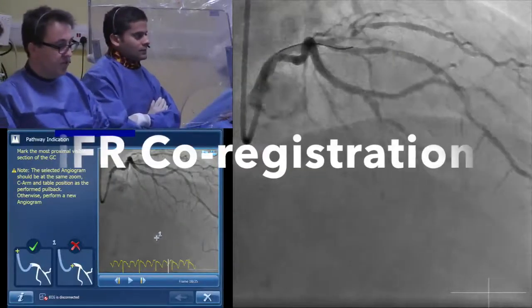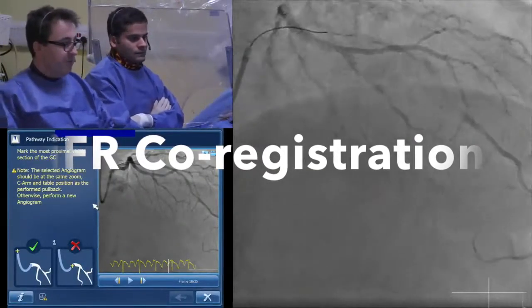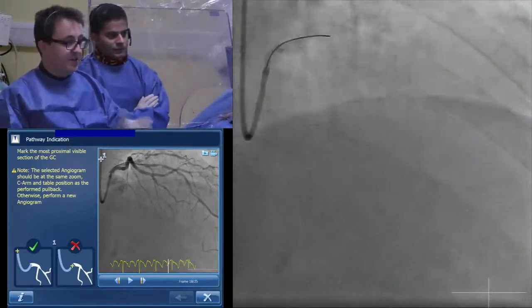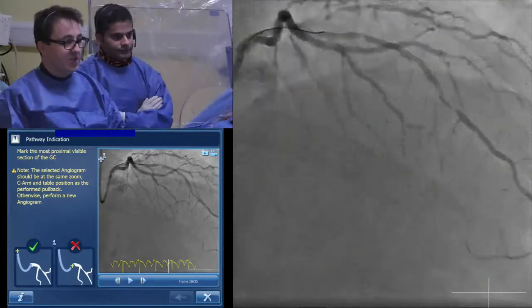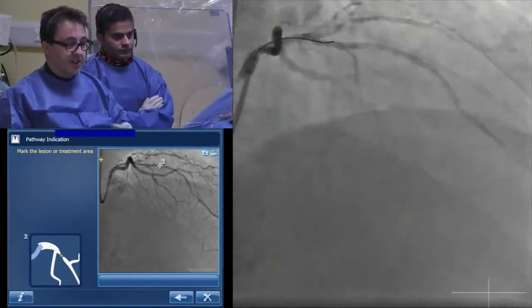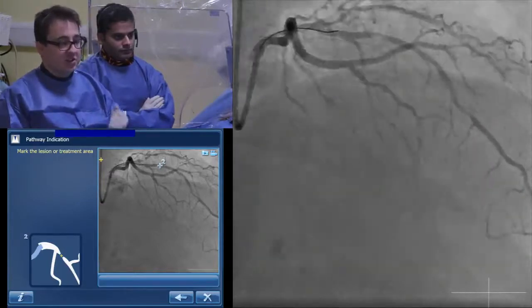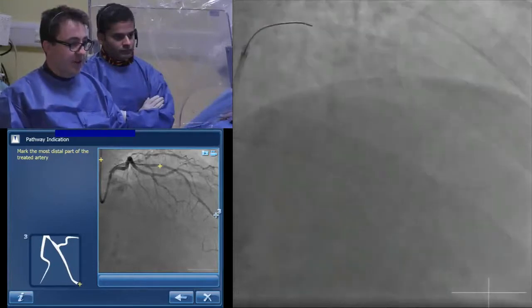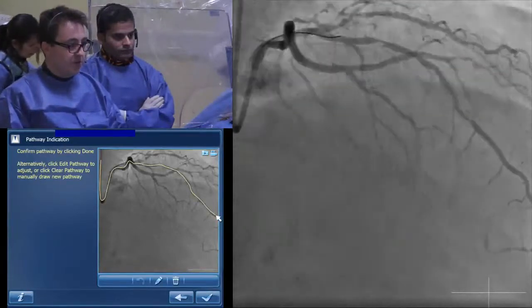I'm going to just start to take control from the table here and mark a few features onto the angiogram itself. This is the co-registration system — I'm guiding this all from a little joystick on my fingers. I just need to put a few markers on it. This is going to be fully automated, but it shows us where the guide catheter is and where the stenosis is. And we put this to where the wire position was as well.